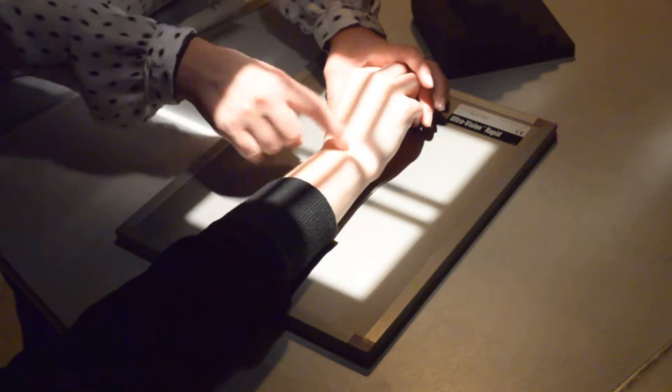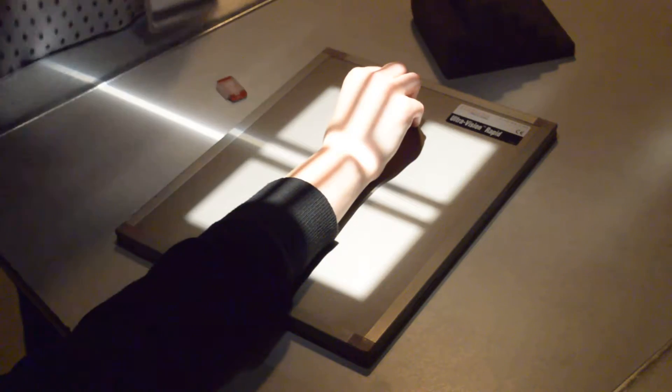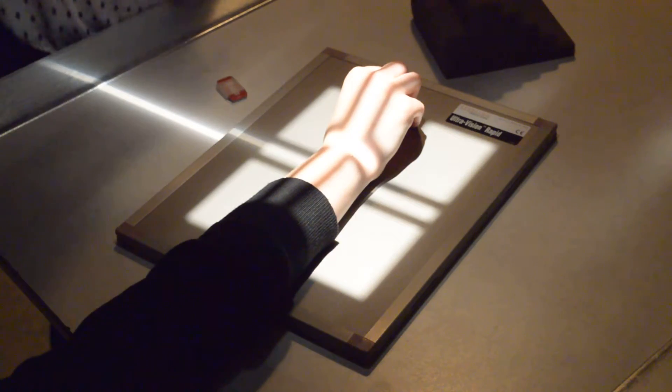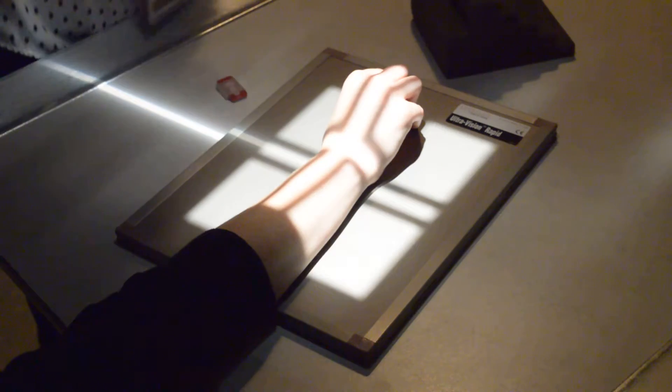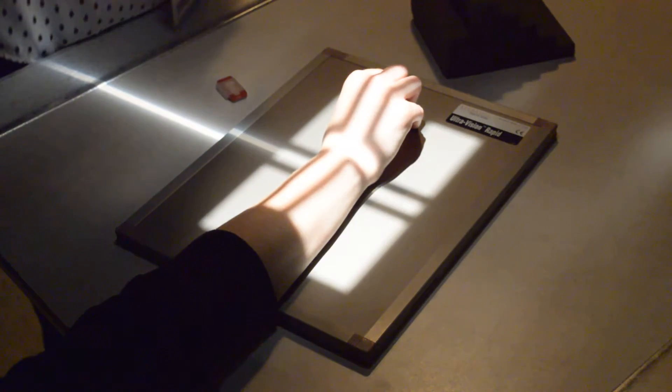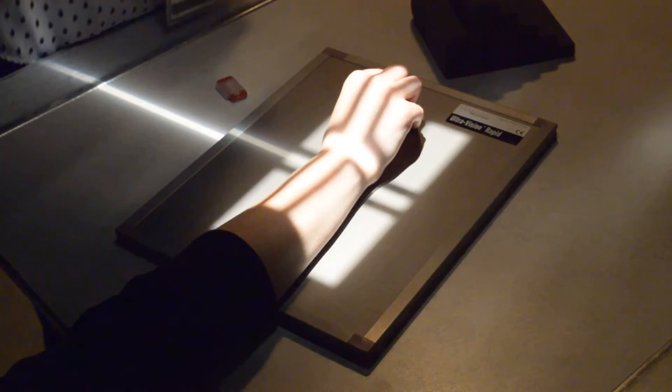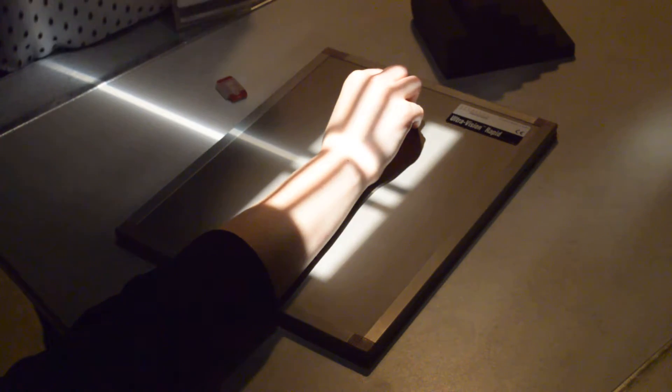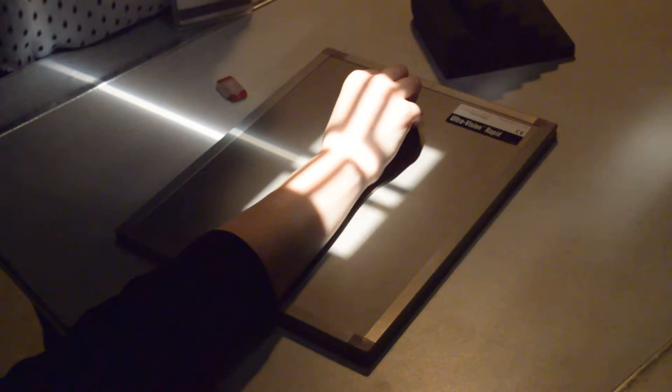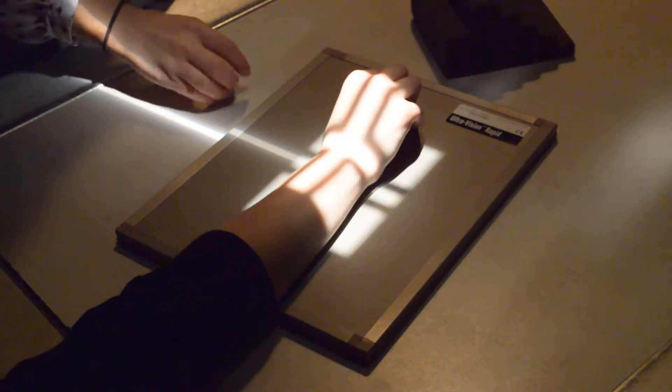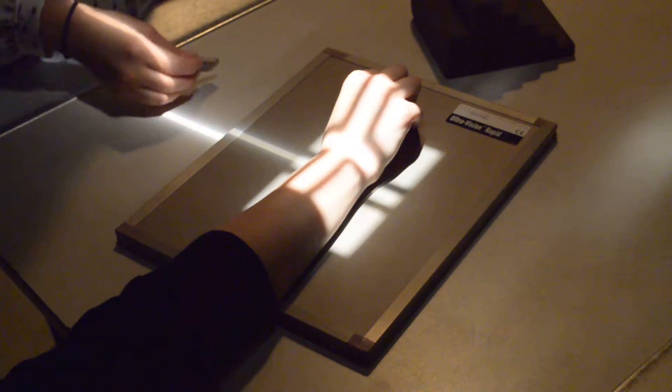You're going to be centered right at the middle of the wrist joint. You want to include the distal one-third of the radius and ulna for this. Collimate down side to side. Get the distal one-third. You will be able to visualize the metacarpals on this.